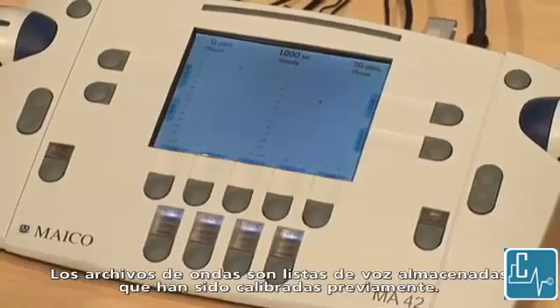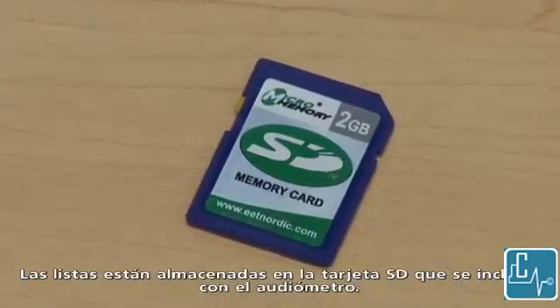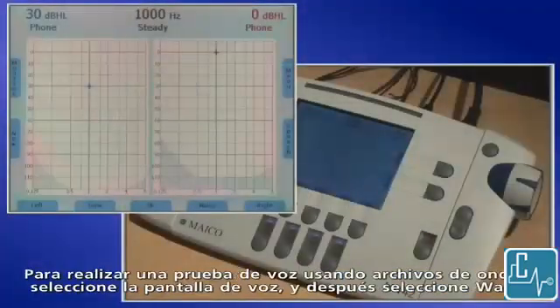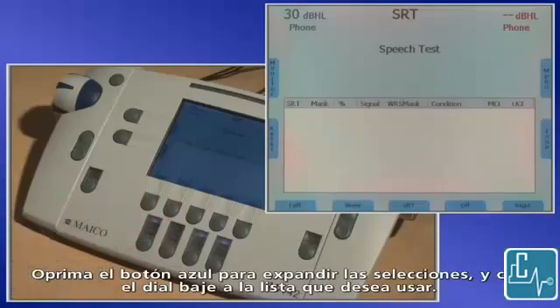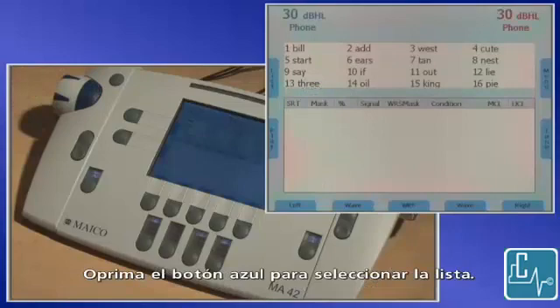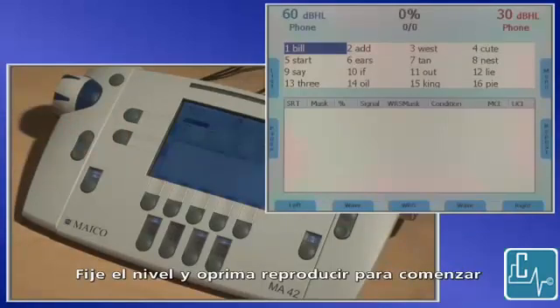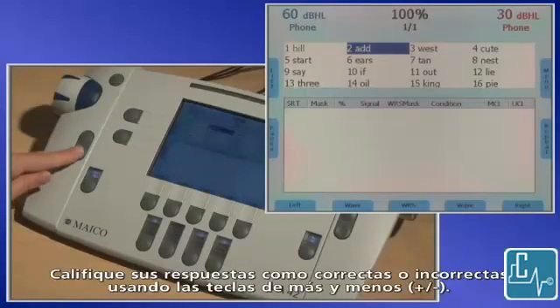WAV files are stored speech lists that are pre-calibrated. The lists are stored on the SD card that is included with the audiometer. The SD card must be inserted in the side slot of the audiometer in order to use the WAV file feature. To conduct a speech test using WAV files, select the speech screen, then select WAV. Press the blue button to expand the selections and dial down to the list you would like to use. Press the blue button to select the list. SRT or WRS will be displayed based on the list that you selected. Set your level and press play to begin. The recorded words are presented to the patient. Score their responses correct or incorrect using the plus or minus keys.